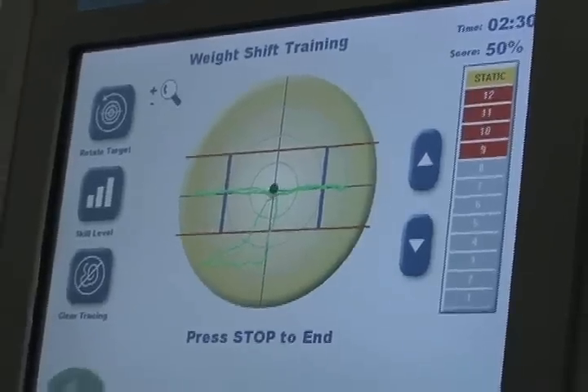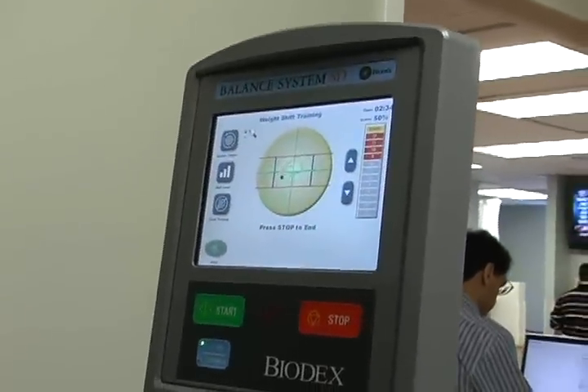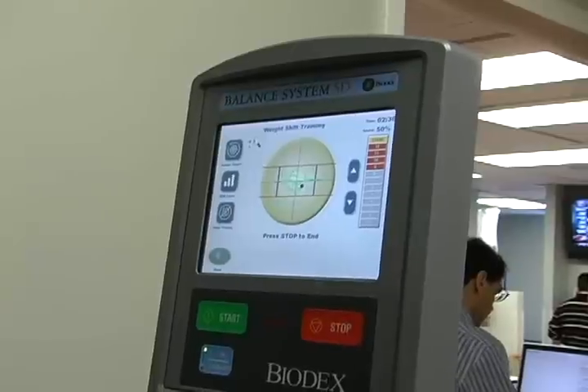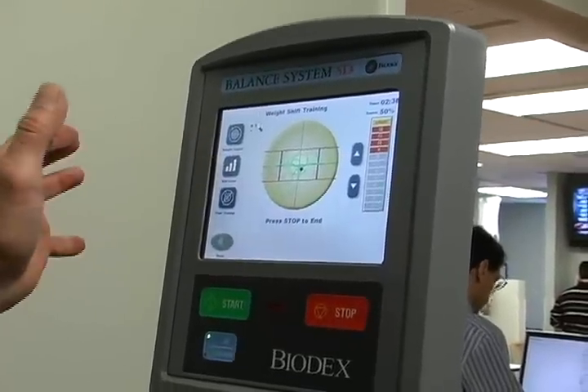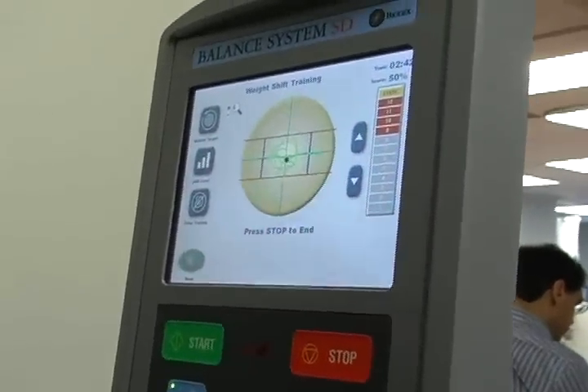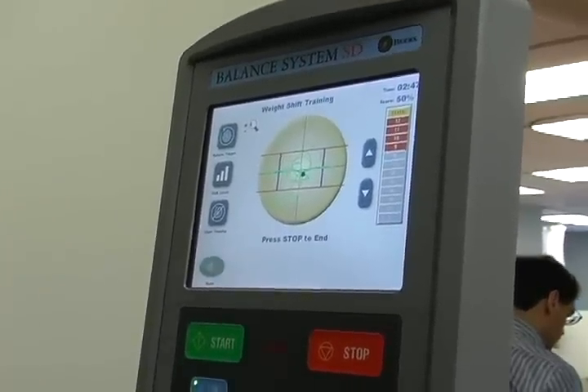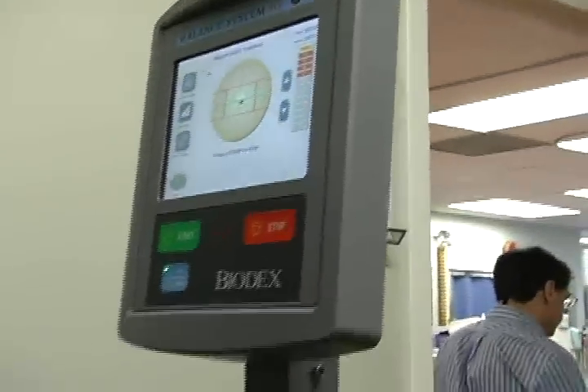Our goal is to try to get you to train within the circle or these bars. We can narrow those bars and bring them closer in together to change the degree of difficulty — starting easy at the beginning and then making it a little more difficult as we move on through the exercise program.